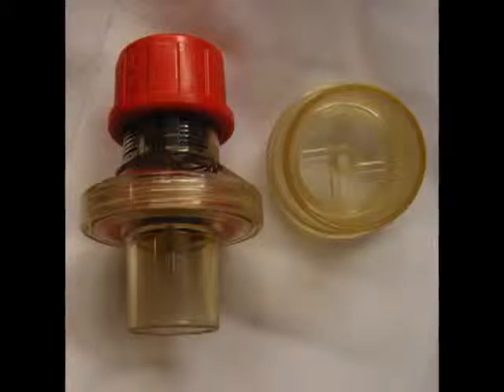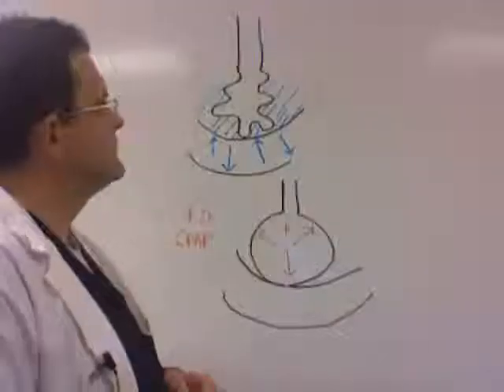All that was required to run the CPAP setup was an oxygen source that was capable of producing an output of greater than 30 liters a minute, the pressurized mask, and a harness that could hold the mask to the patient's mouth and nose, and finally this PEEP valve. And it was a very simple setup, and it worked very well.